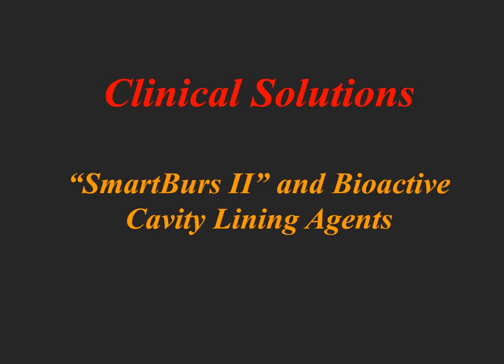Let's continue now with a little bit more of a discussion on SmartBurs II and bioactive cavity lining agents, because this whole story is important as far as the diagnosis, the minimal preparation, the conservative decay removal, and differentiating between infected and affected dentin. Affected dentin can still be remineralized when calcium and phosphate are available.